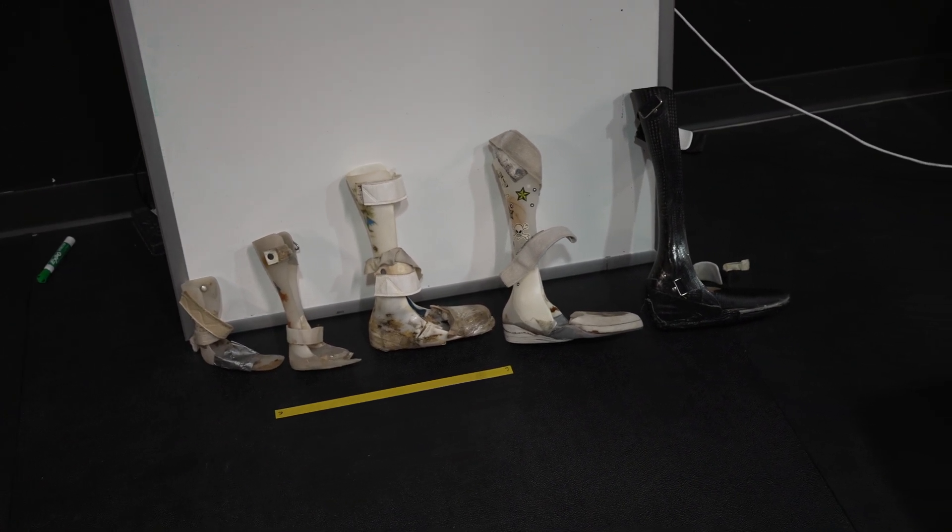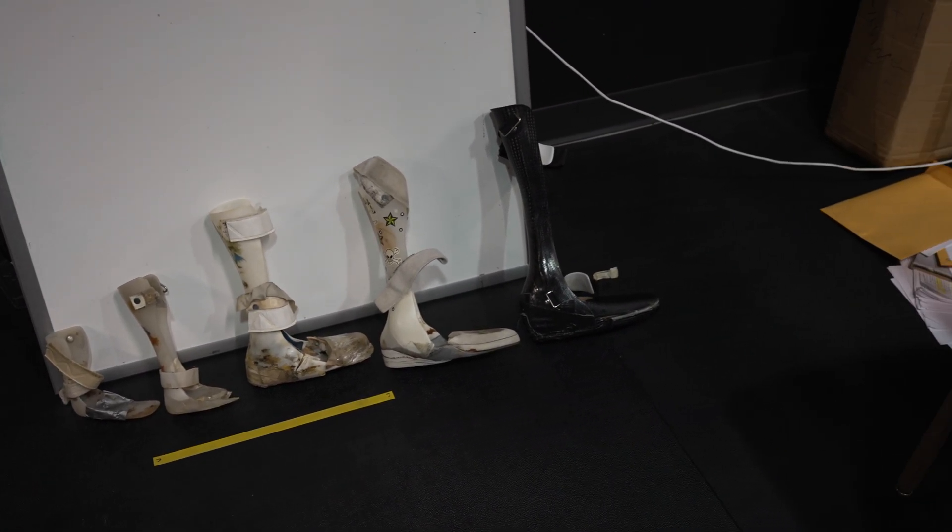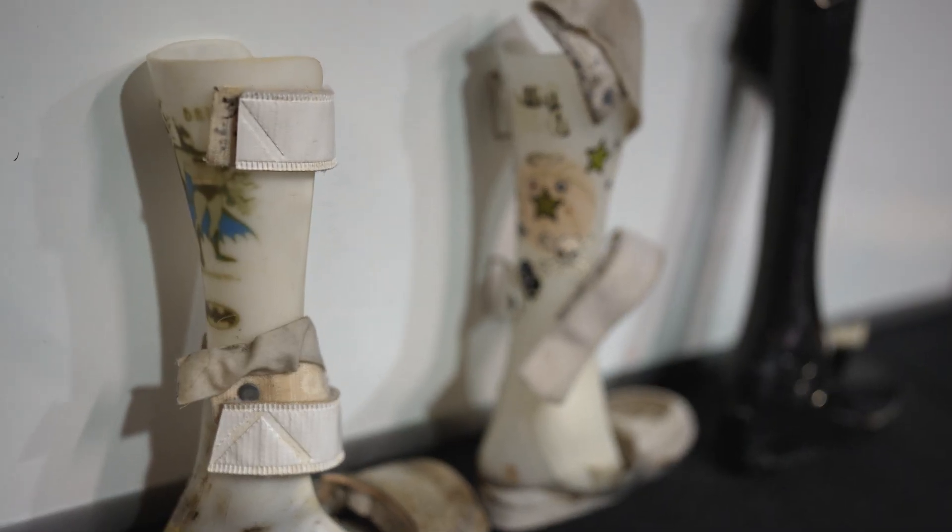With it being new, there wasn't a lot of braces that had those many features of a regular brace or a regular foot.